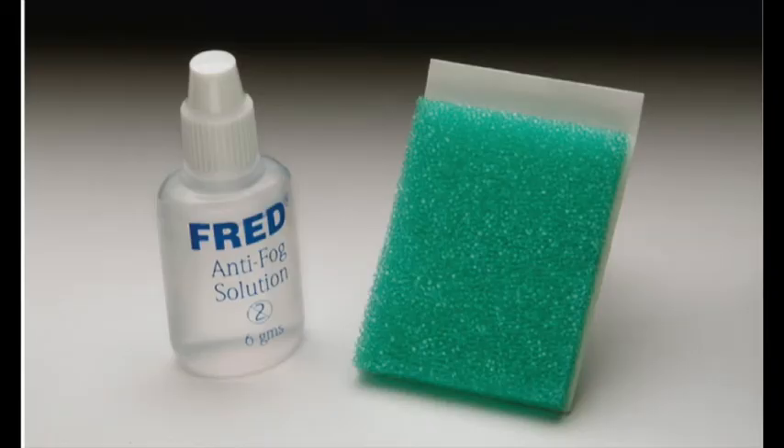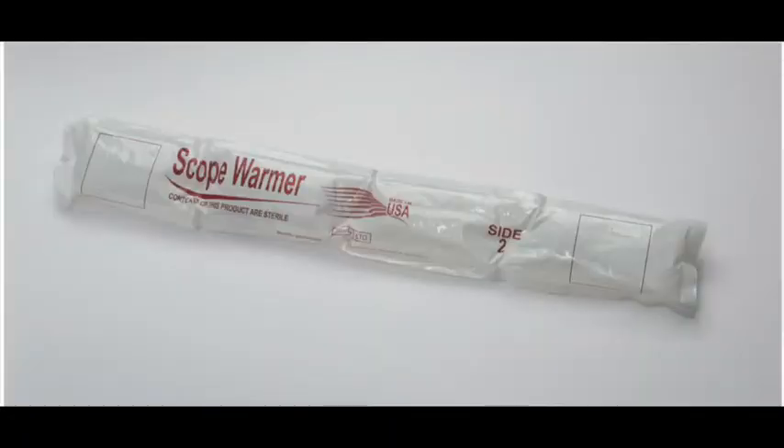The first time you get into a laparoscopic case, you'll notice the camera can get foggy because of CO2 pressing against it. The doctor will sometimes use an anti-fog solution. The surgeon will have a green sponge close to the camera on the field, and we use the FRED solution — pouring small drops onto it to provide anti-fog. Remember, this is a countable item, so it is part of your count. Other places have a lens warmer, which keeps your scope warm.